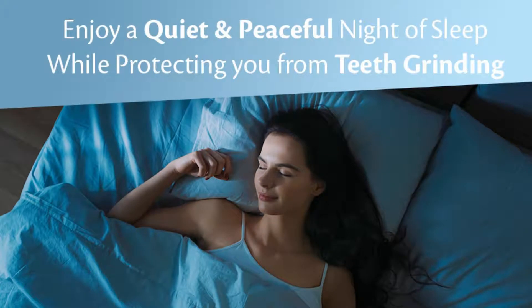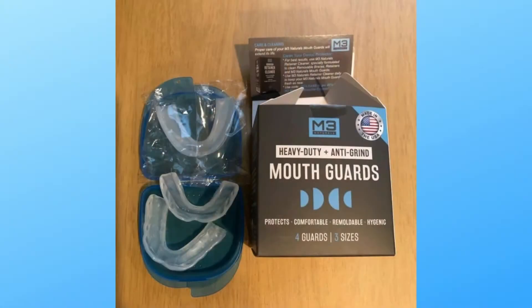With a moldable fit to prevent bruxism and clenching, the Ultra Comfort Guard relaxes jaw muscles, prevents teeth biting, grinding, and clenching, and alleviates problems that may cause potential dental injury.